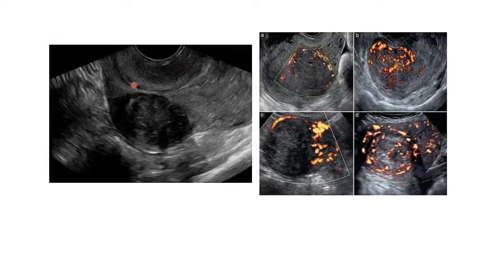So look here, that's our uterus there. You can see here there's a fibroid there, and this is the canal there. That is the canal, that's the body of the uterus. So you can see here this is a subserosal fibroid. So fortunately, this type of a fibroid, you can easily see it. Why? Because it is slightly hypoechoic as compared to the rest of the uterus. So this is hypoechoic. So this is a subserosal fibroid.